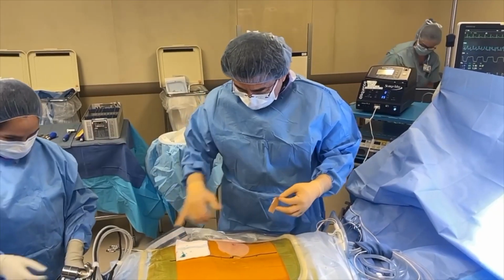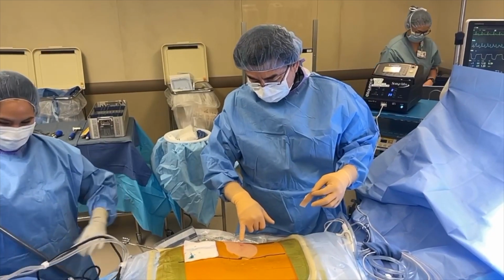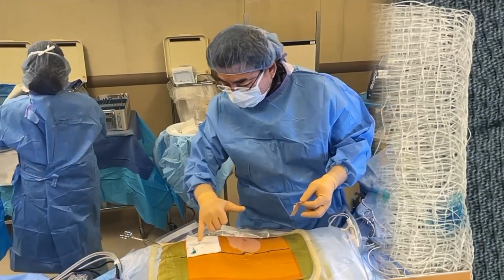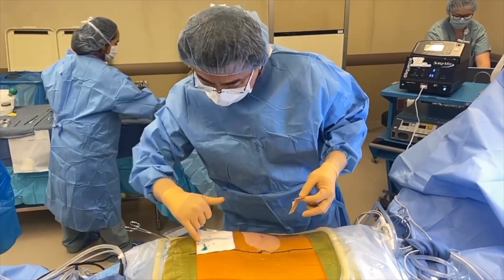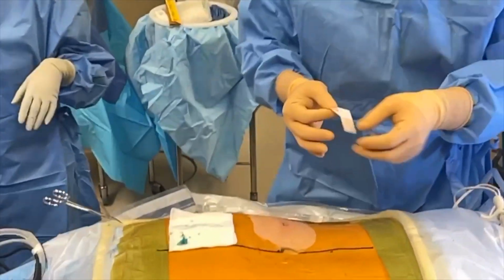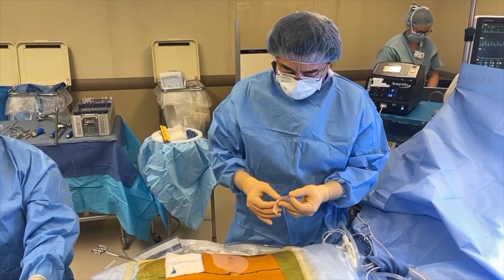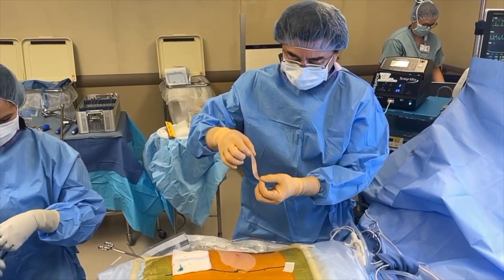Surgery's all done. We did it through that little poke hole, and I know you're allergic to the absorbable suture, so we just put a little bit of skin glue. And now for the Band-Aid. And these are the pieces that we collected. There's way more pieces than that, but that big chunk right there came flying out as soon as I put the endoscope in. It was yearning to escape. It felt really good. It was like popping a pimple, if you're into that sort of thing.